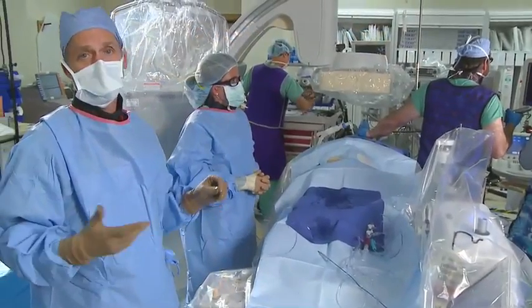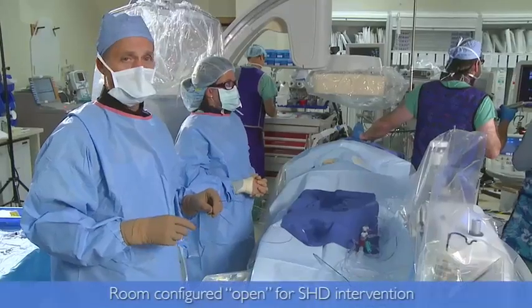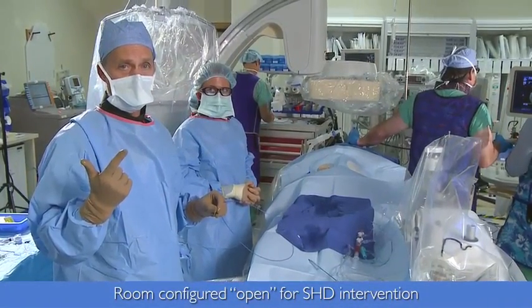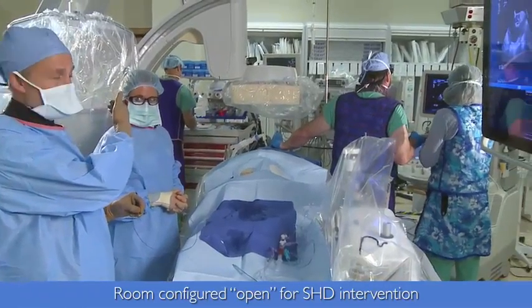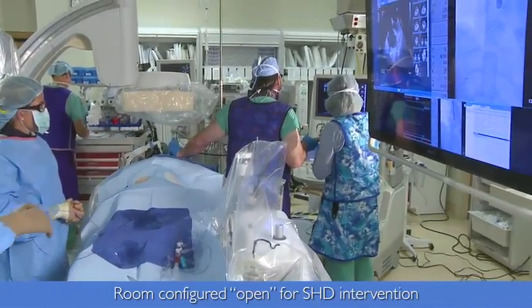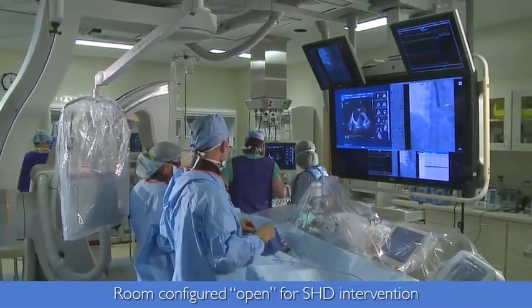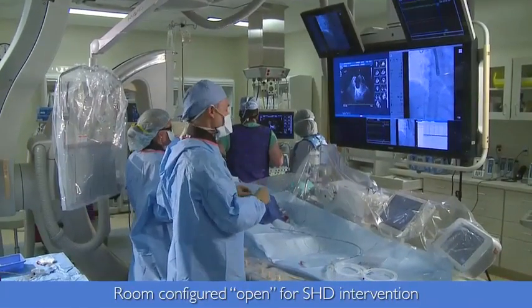Notice how we've reconfigured the room for a structural heart disease case with general anesthesia with 3D TEE guidance. We've moved the gantry 180 degrees so it's out of the way of the echo team and out of the way of the anesthesia team. And so they have complete access to the patient's left side.